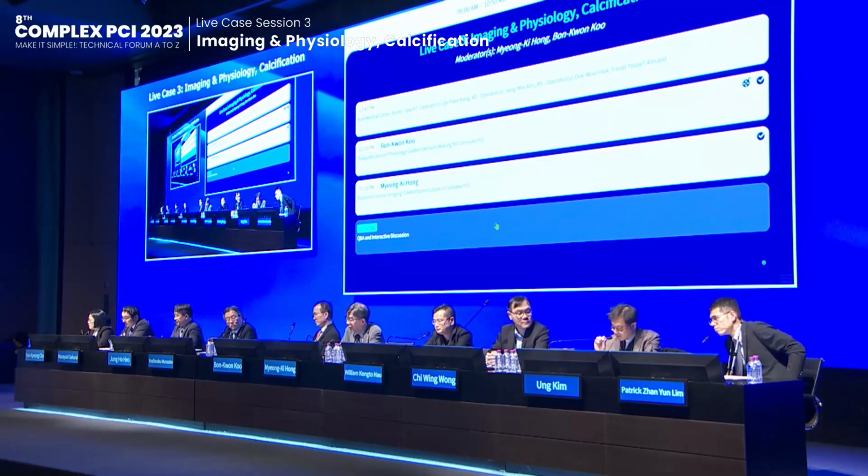I have a question for Dr. Koo about the iFR and FFR correlation. Generally iFR and FFR are well correlated, but sometimes they are not. In that case, I always check the FFR again and decide according to the FFR value. So why does that discrepancy happen?